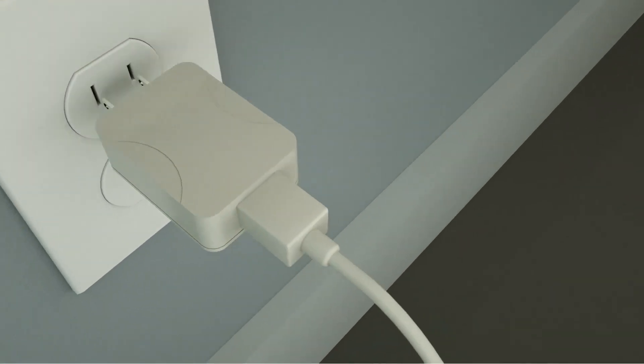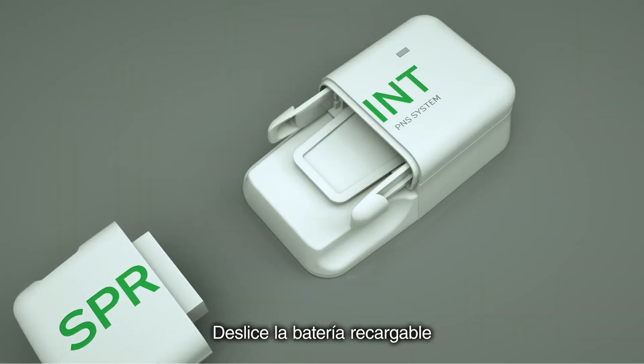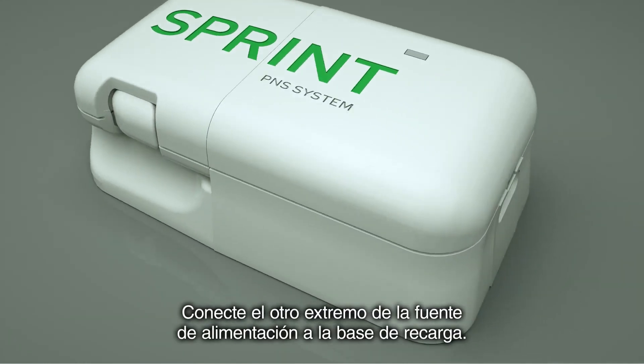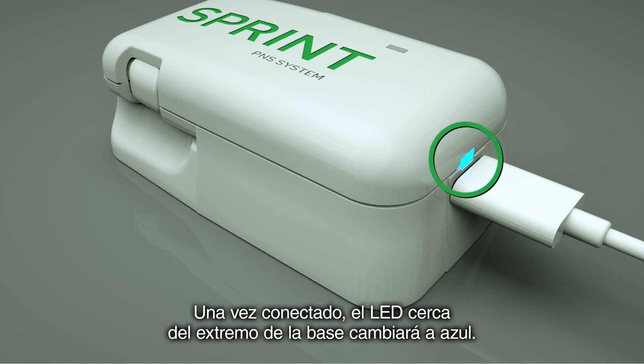To begin charging your battery, plug the power supply cord into a wall outlet. Slide the rechargeable battery into the recharging base until it clicks into place. Connect the other end of the power supply cord to the recharging base. Once connected, the LED near the end of the base will turn blue.